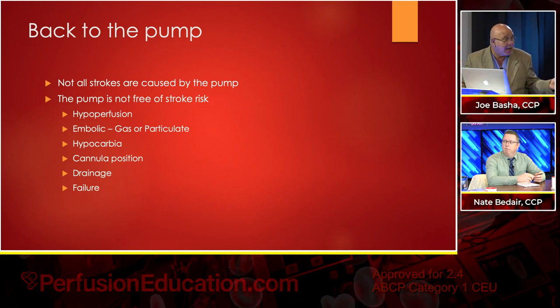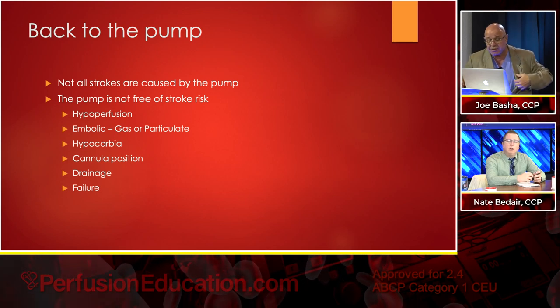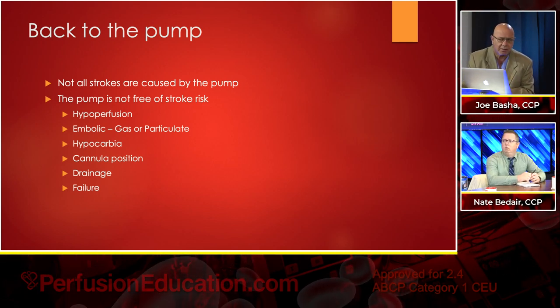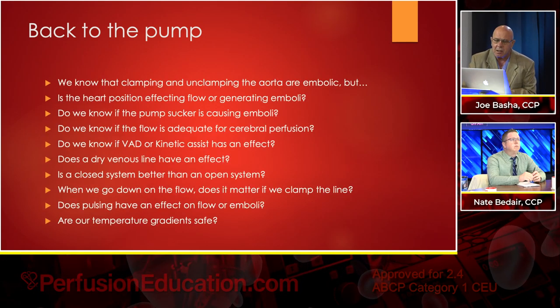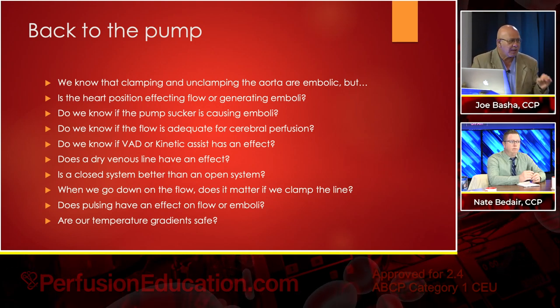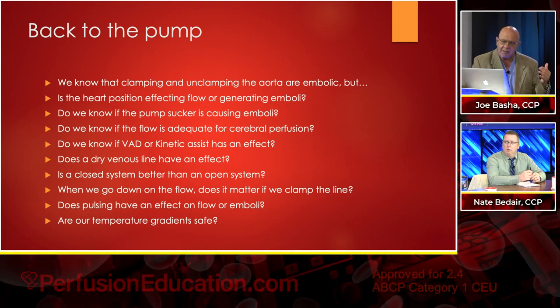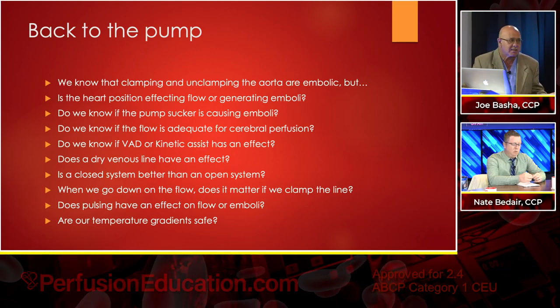Yeah. And I've had it happen to me before. I've had it happen. And so, you know, it's concerning. You had a confirmed stroke? No, I just had a CO2 that low and fixed it right away, but it made me a little nervous. Disconcerting, certainly. We know that clamping and unclamping the aorta are embolic. Right. We know that. Absolutely. You remember the days of the Embol-X catheter? Yeah. They would find debris in that thing every single time they sent it in. And frequently we saw huge chunks in it.